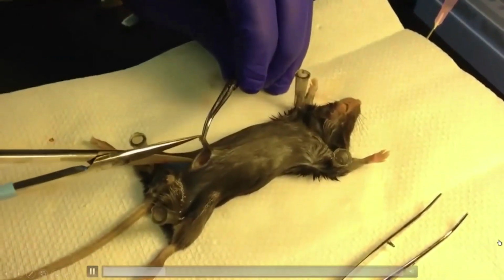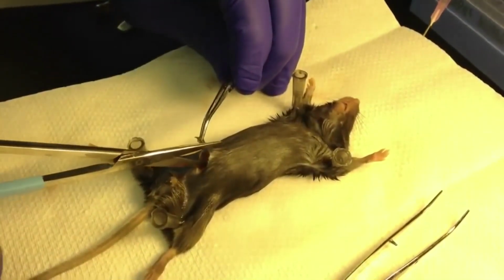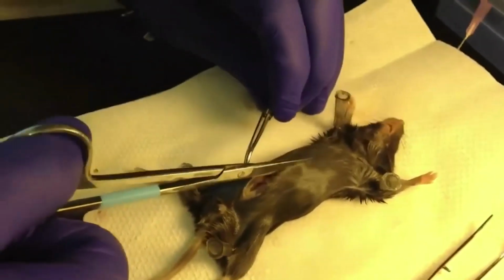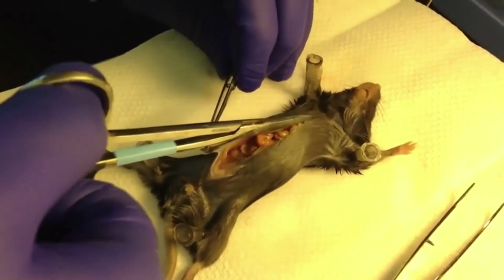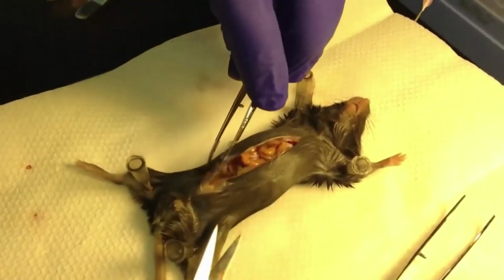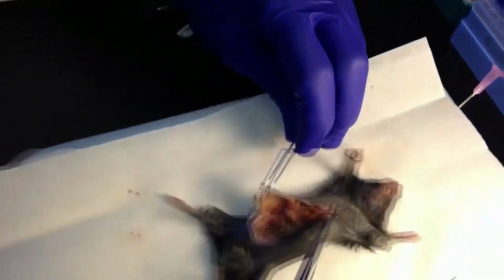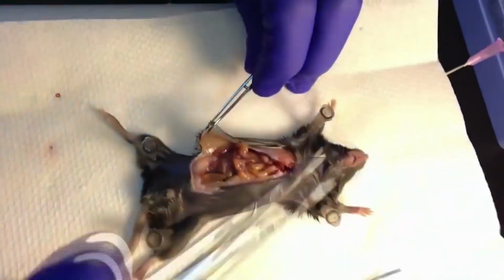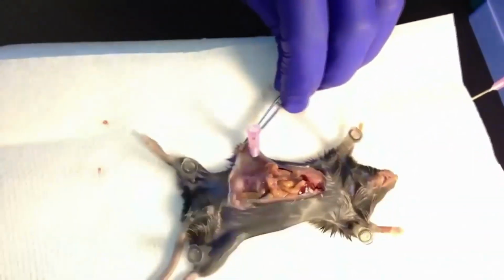And then you'll see this filmy layer here. What you want is the tip of your scissors to go through that. And then you're going to cut up. So you're cutting basically the layer of film and also through the skin. And you're going to cut all the way through the sternum. Okay. And so now you're going to make some incisions on the sides. This is just to open it up to see what you're working with. It's not necessary, but you can pin this if you want to get a better look.